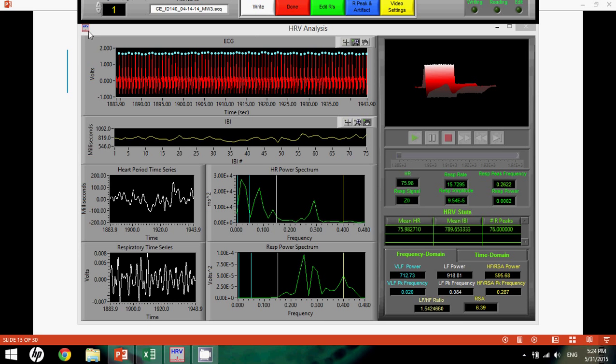Of course, when you're doing this research at the Institute, you'll have that older version of the Excel program. It'll automatically output that data, and then once you're completed fully with either manually writing those or auto analyzing all of the data to that Excel output file, then you can just come up here and click Done.